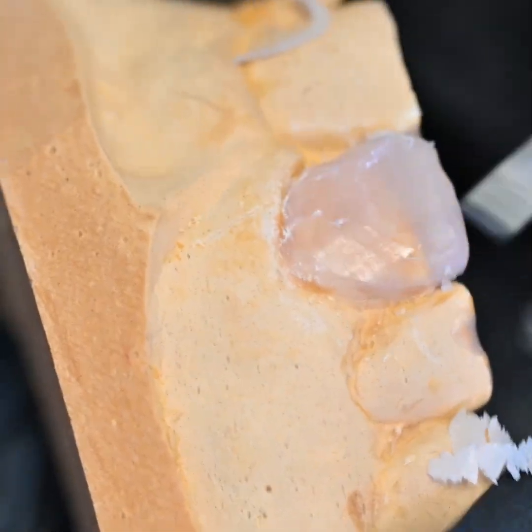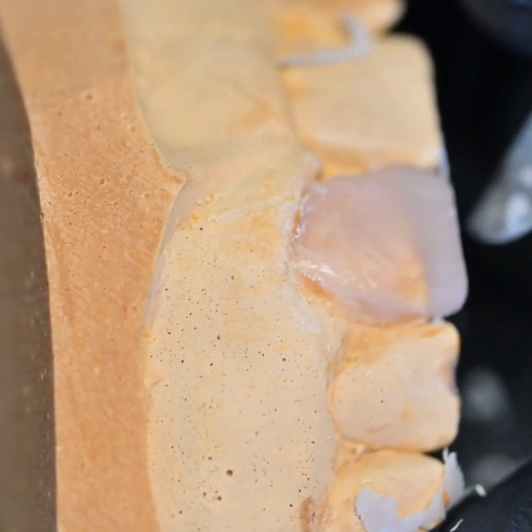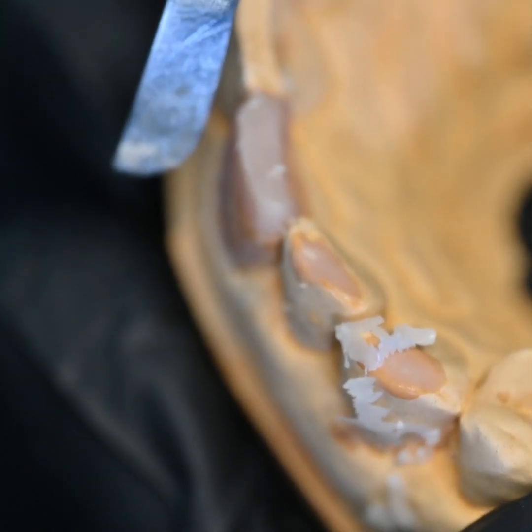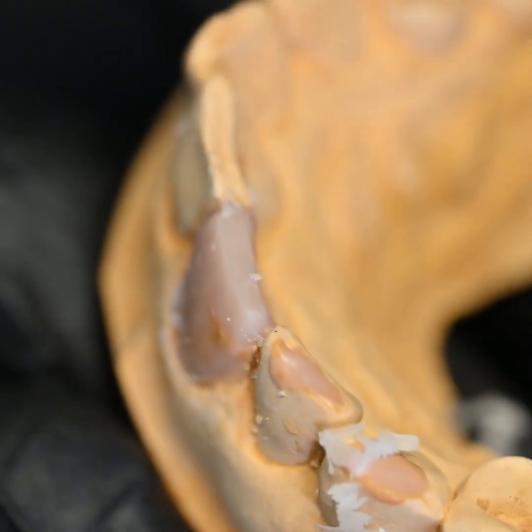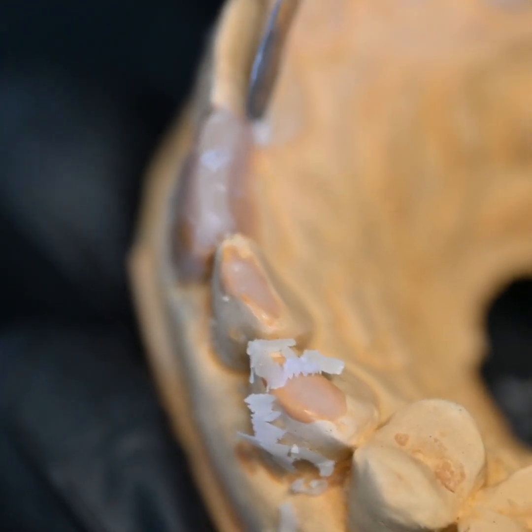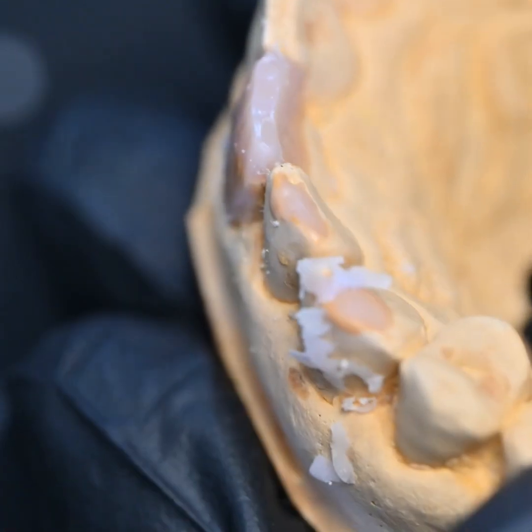Recently I visited Florence and I saw the David statue by Michelangelo. There is one beautiful thing the sculptors say: when you carve marble and sculpt, it's not that you are making a statue — it's basically you are uncovering that hidden individual who was trapped in that stone. I felt that here too — from a block of wax we carve and uncover the tooth. As dentists we are really a proud community of the artwork that we do. Coming back to the carving: it's simple, just follow the instincts and the anatomy and you will be there.